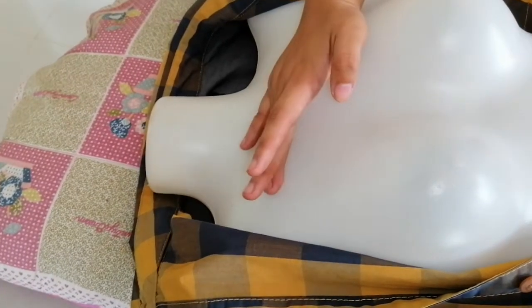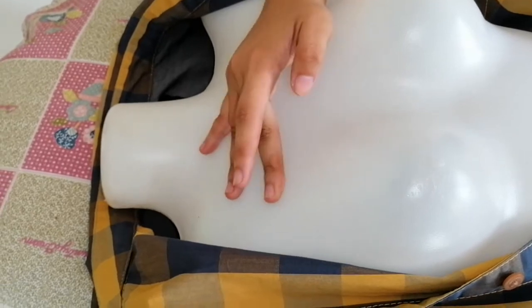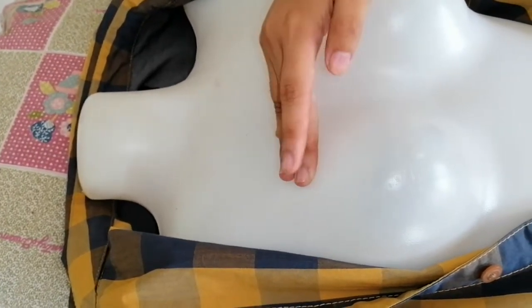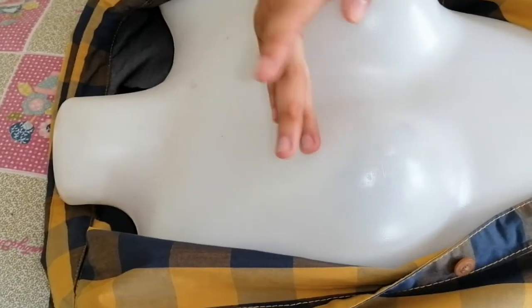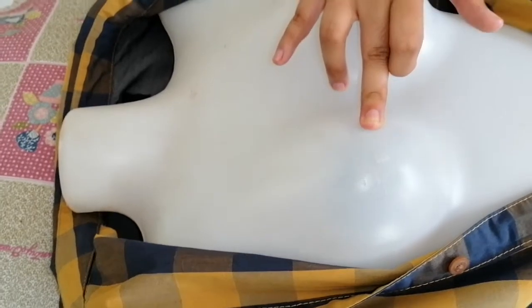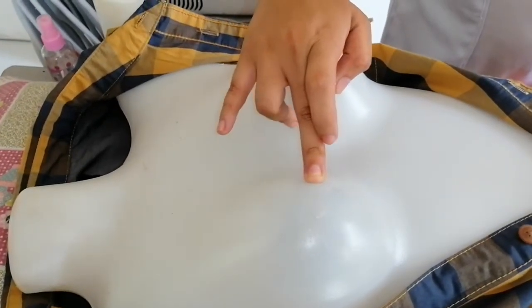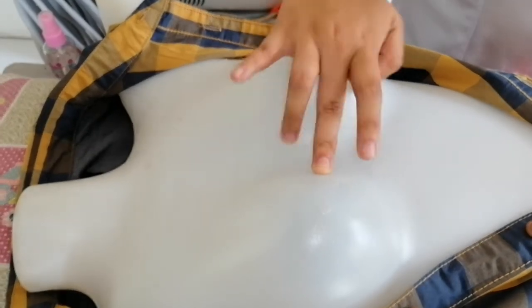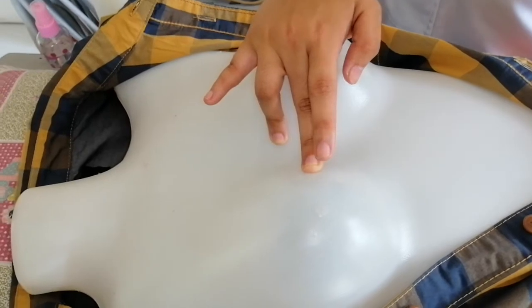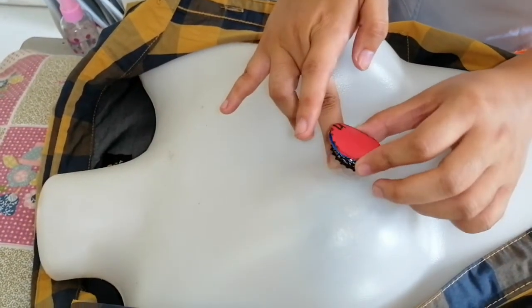Let's say, for example, I begin here at the border of the line. Then 1. Then let's begin to palpate. 1, 2, 3, and 4 at the right sternal border. So we need to draw a lateral line going to the right sternal border. So this is the V1. We're now going to place the V1 on the located part.